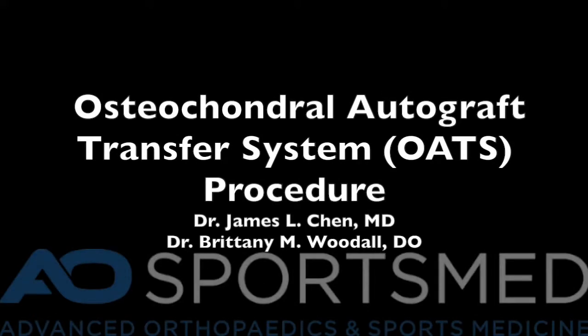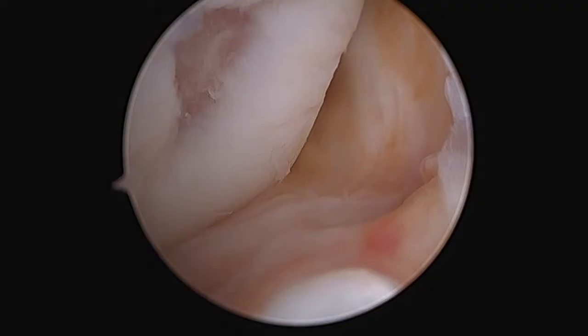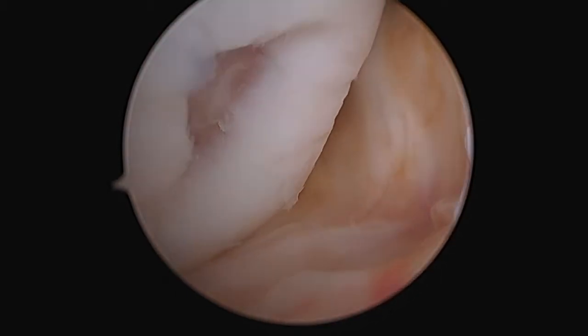This is a video on an OATS procedure in the knee. This is a view demonstrating the articular lesion.